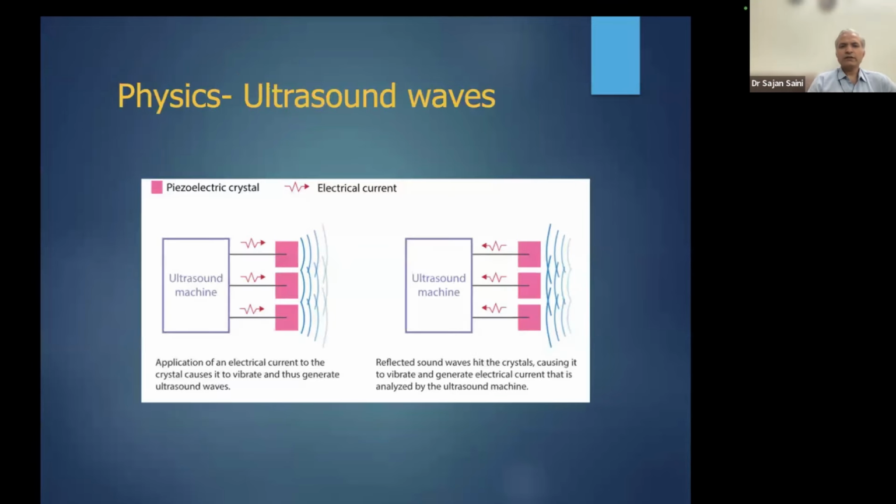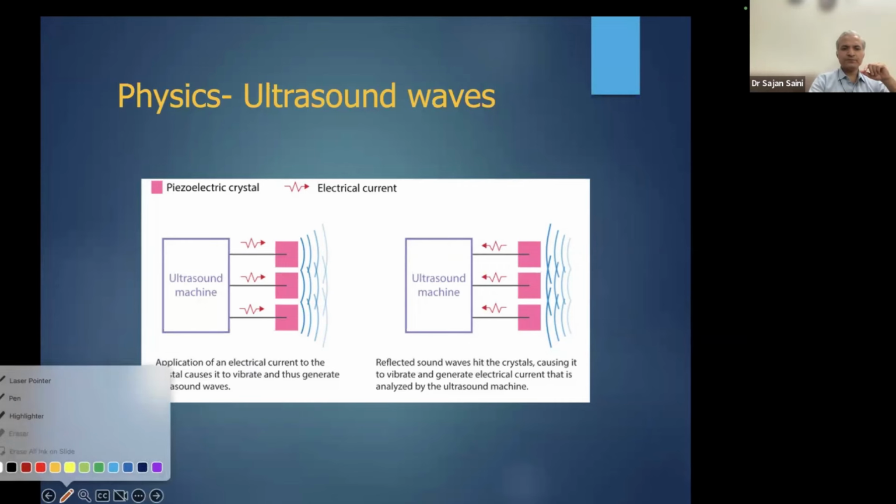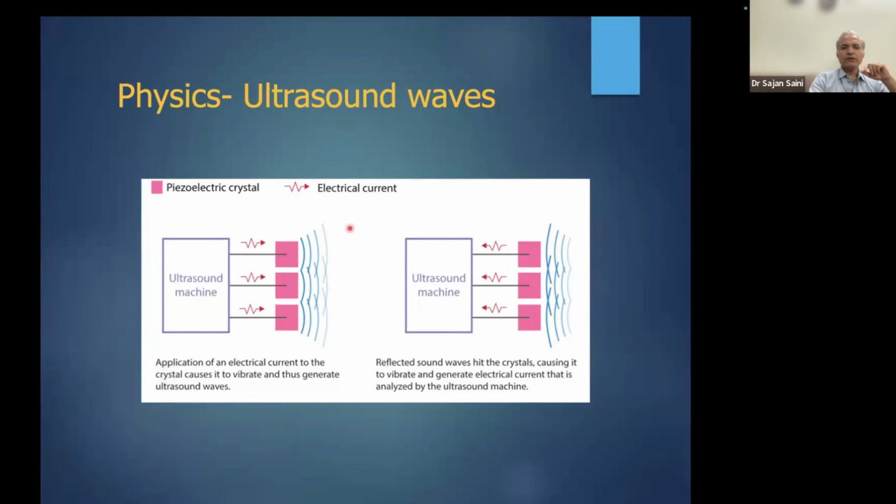So let's kickstart. The first thing is learning about how ultrasound waves are produced. This is a schematic diagram of an ultrasound transducer.